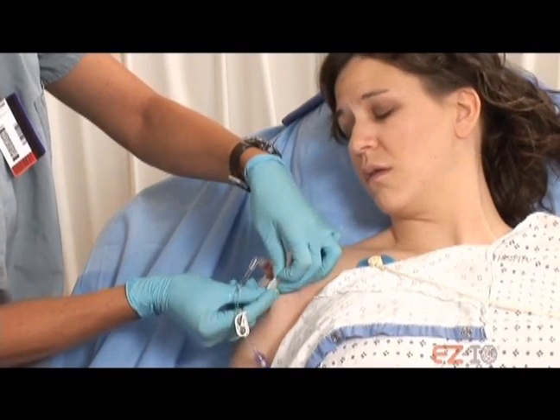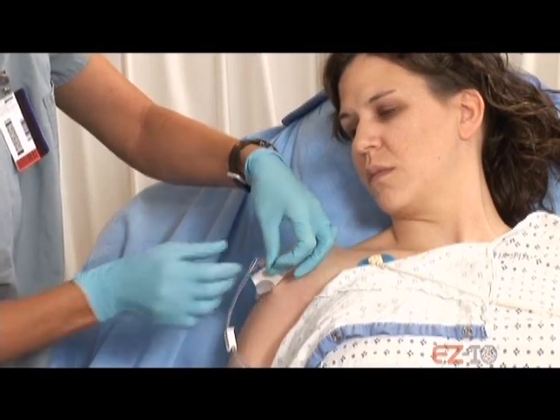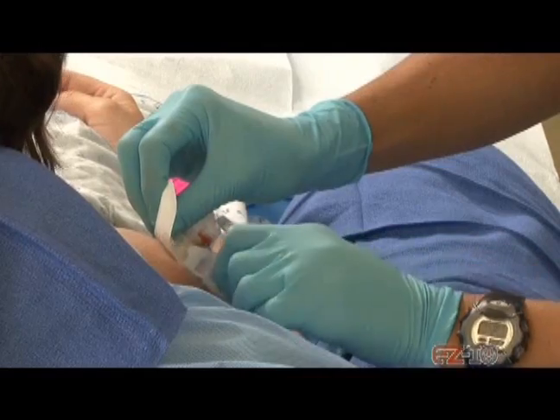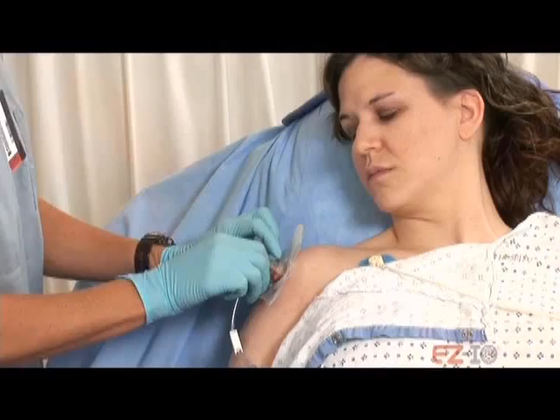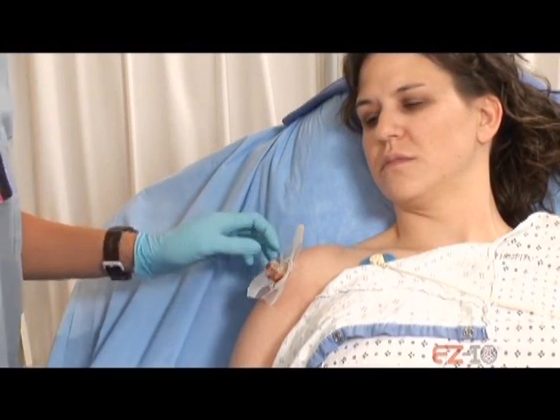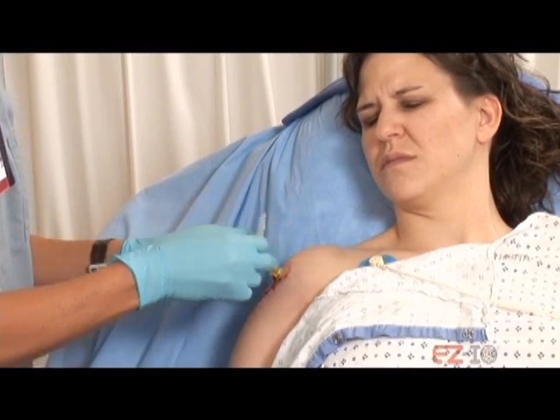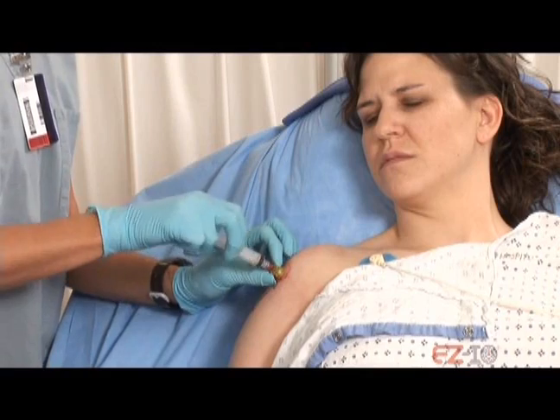Doing okay? Mm-hmm. All right. Okay, so now I'm just going to take this off, and I'm just going to pull this right back up and over. So this is just the stabilizer, it's not taking the needle out. And then I'm just putting a syringe on there.